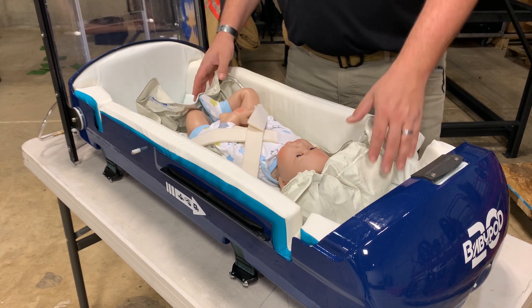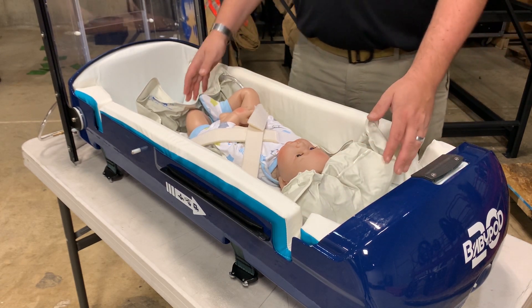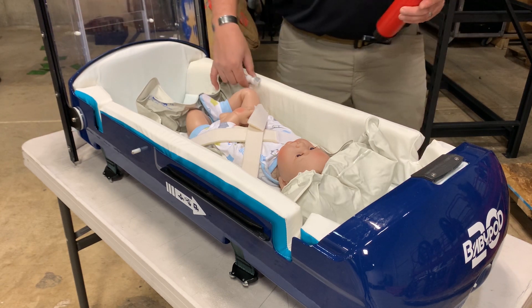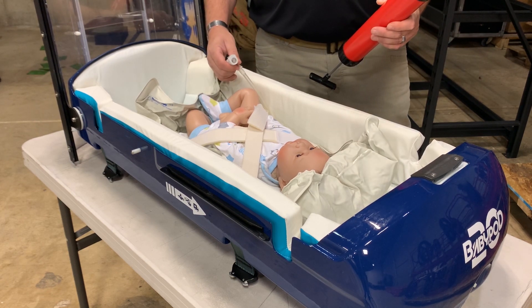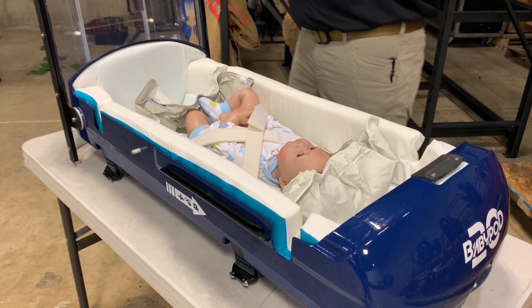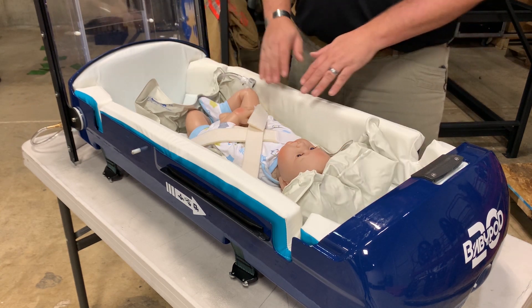Next, we have a vacuum mattress. The way this vacuum mattress works is it's kind of like an air cast — you take the provided pump, swaddle the child in the vacuum mattress, and then apply suction to the mattress itself. That will make a rigid yet soft cocoon that keeps the child in position and provides an extra layer of protection.